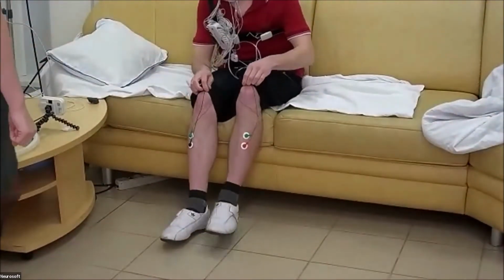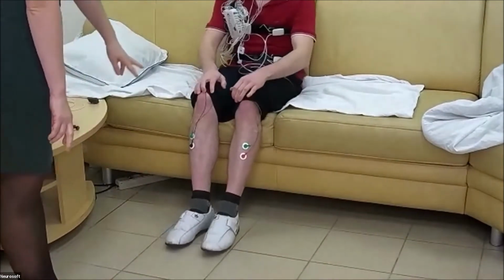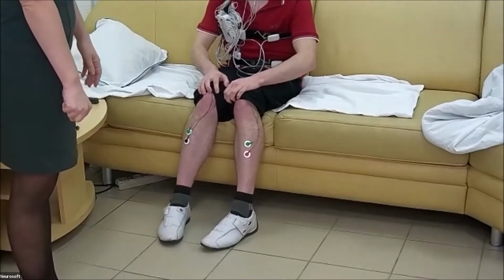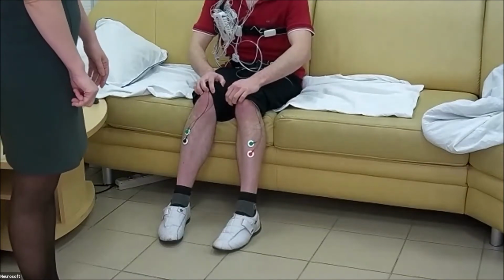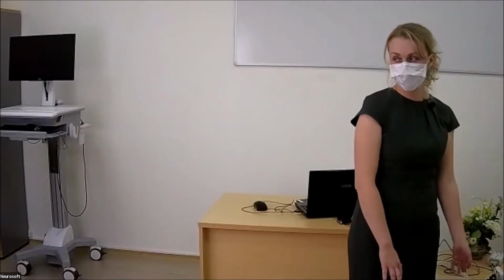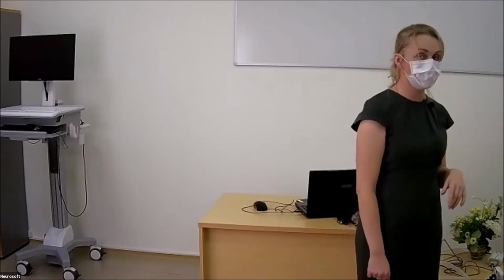They put the electrodes on the anterior tibialis muscles at the middle part, with a distance of 2-5 centimeters, and to record the signal reusable or disposable electrodes could be used. Of course, with cable from these electrodes, we connect to the patient unit.